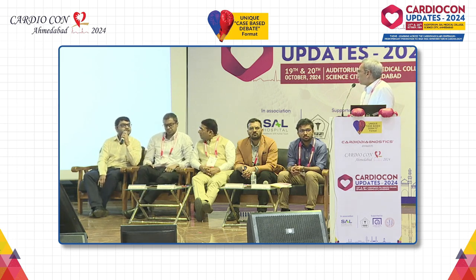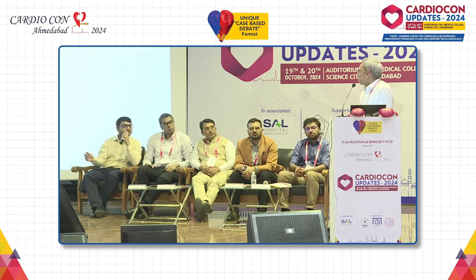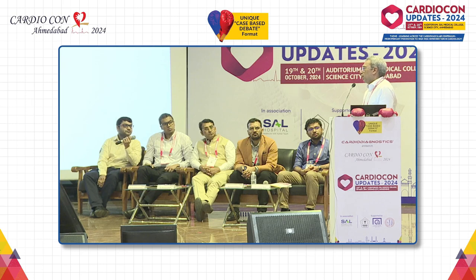In this case, besides the left bundle lead, should we place the ICD lead also? I think we should, because there is a scar. We are doing a procedure, we are already giving. Yeah. So on that argument of doing the procedure and putting an ICD, probably I would not, because this patient has got scar.